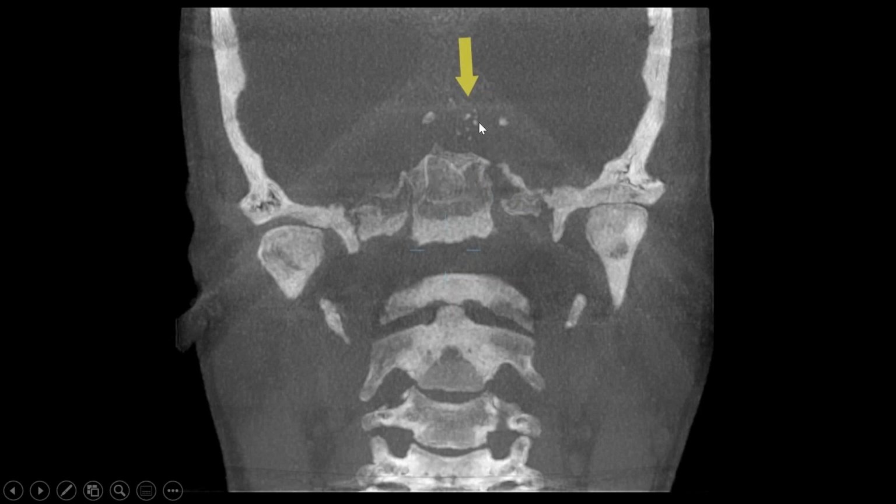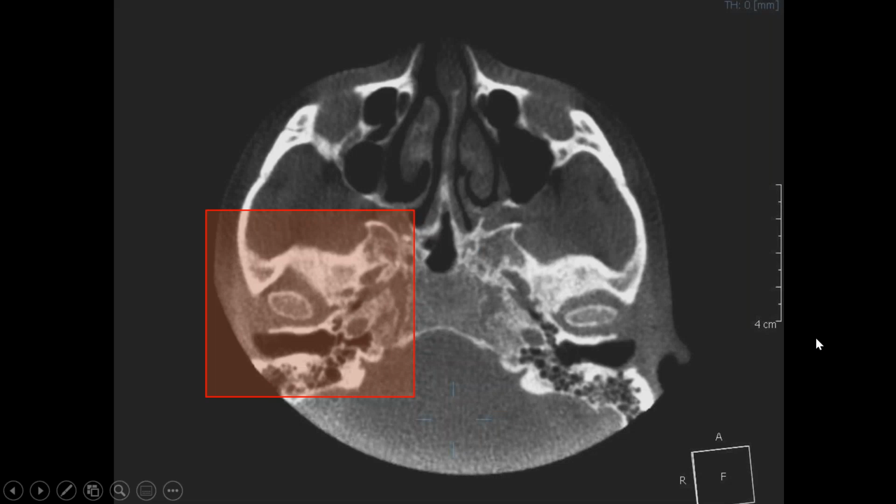So pituitary tumor, here it is in a coronal planar section. These are the clinoid processes. This is tumor. And you can see the condyles. So if you go up to get the condyles, you will catch that region.